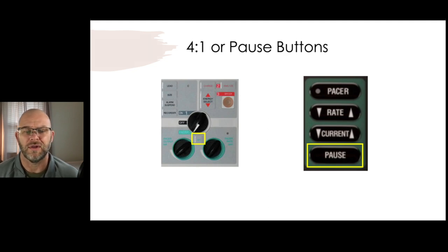What about the four-to-one or pause button on the Zoll and Physio monitors? If you want to see what the patient's underlying rhythm is, you can hit that pause button — it takes the pacing rate down to 25% of your set rate. So if your rate is 60, it'll only pace at 15. Hold the button down and you can see if they're still in heart block or asystole, and when you let go, the rate comes right back up without adjusting anything else.